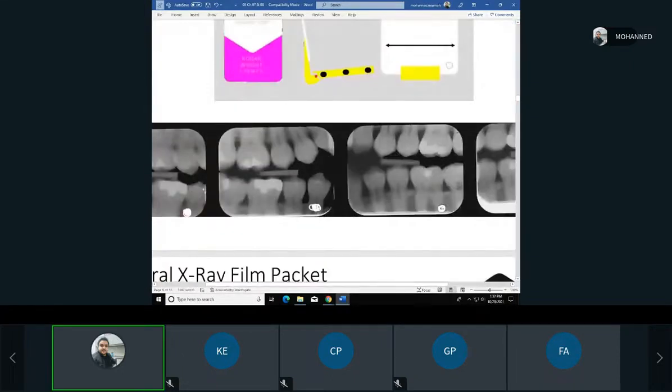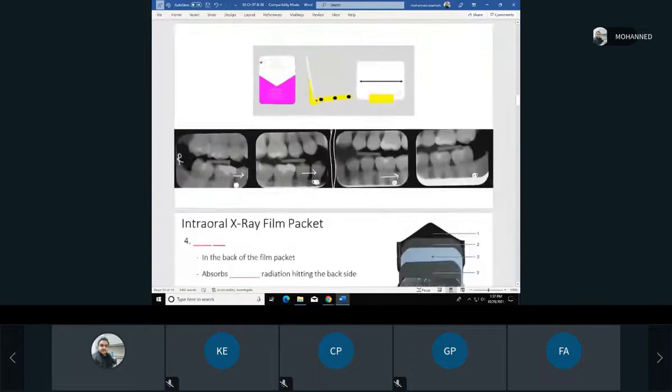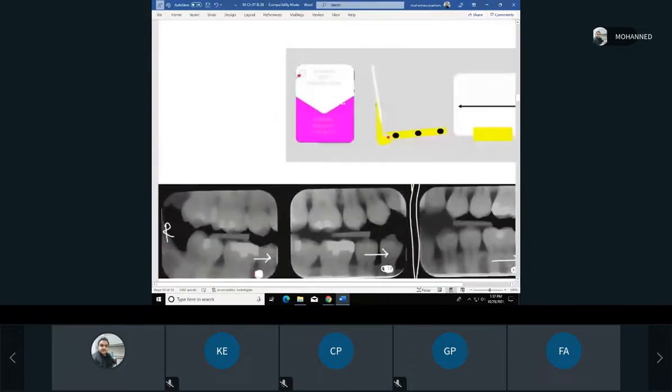To the premolars, between the premolars and the molars. They're close to the mesial of the patient, going mesially towards the middle. While on the left side of the patient, it's actually distal from the midline of the patient, right? Does that make sense at all? Yes? Okay. I guess you just want me to continue, even if it does.